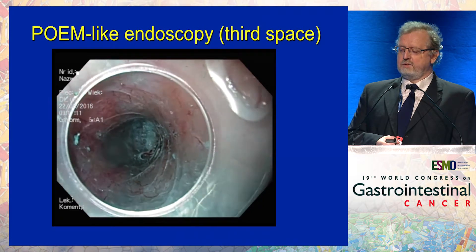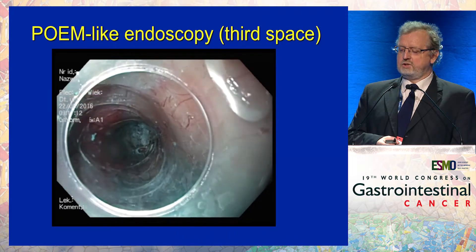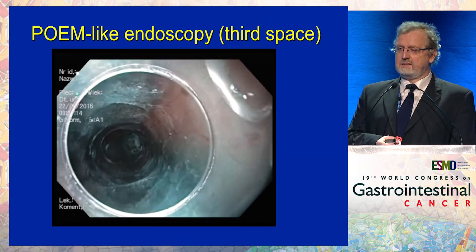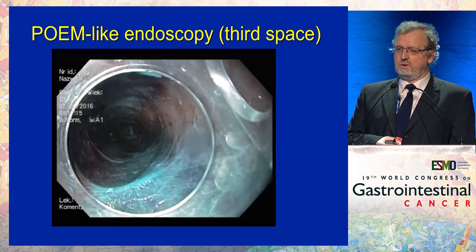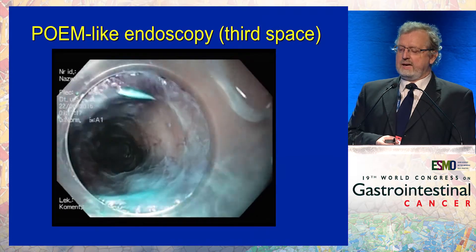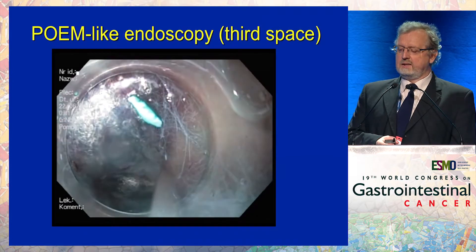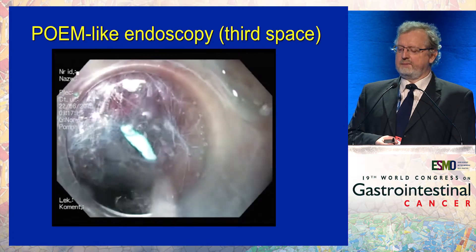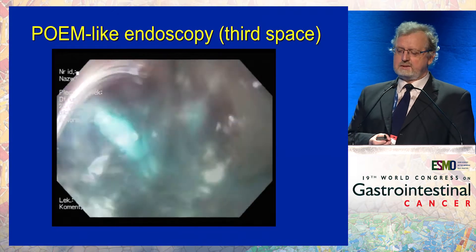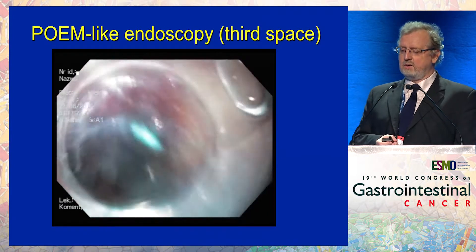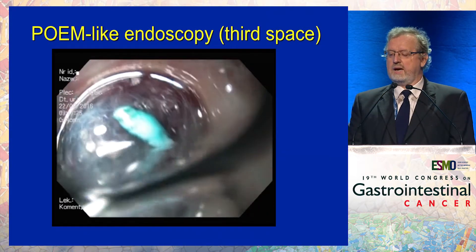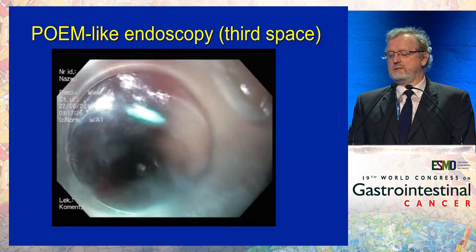Going down, going down. Now you can see this tunnel — this is within the esophagus wall. We are inside. And this tunnel allows us to cut the muscles at the lower esophageal sphincter.